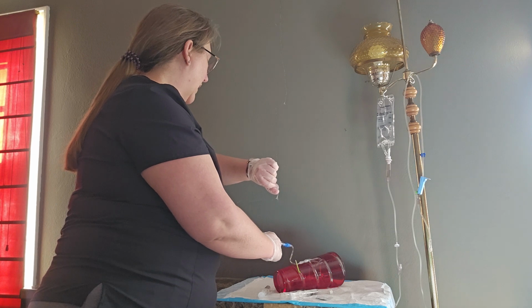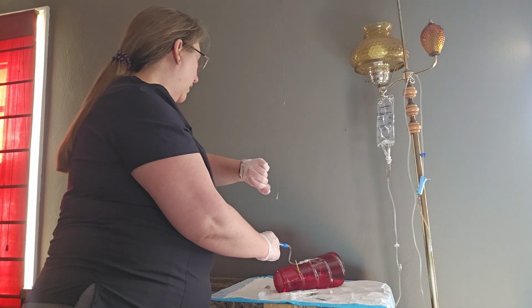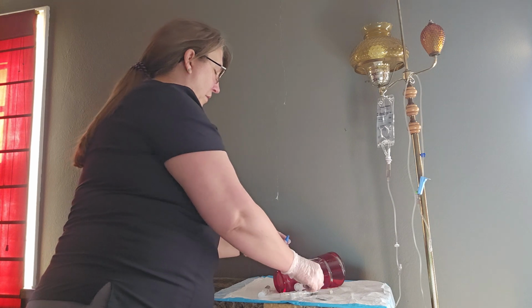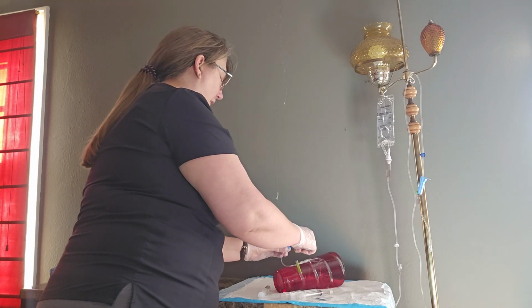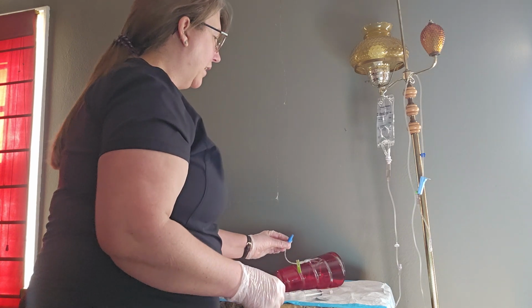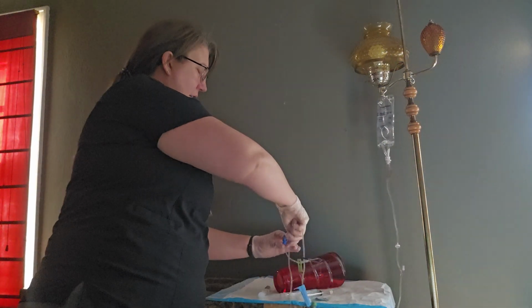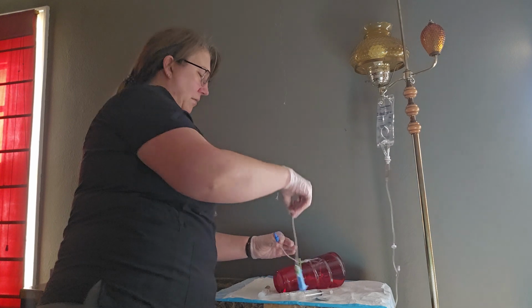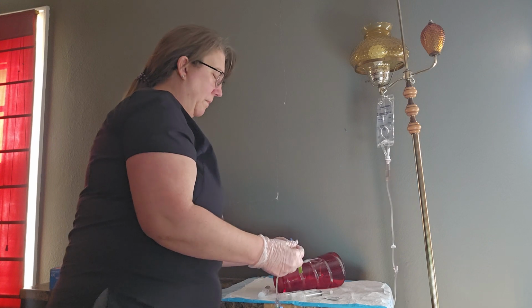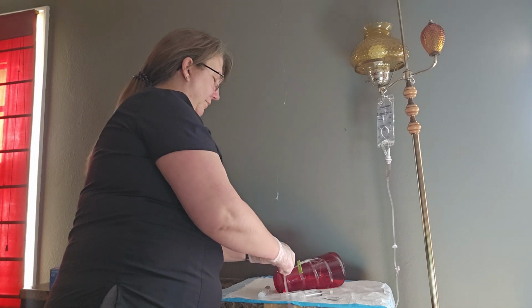So I'll stand here and time it at 1 minute with my second hand and push very, very slowly for 1 minute. 1 minute's over. Put that down. Scrub the hub with my antiseptic wipe. Allow to dry. And then come over here and take my IV, scrub that hub as well, allow to dry, and reattach. Okay.